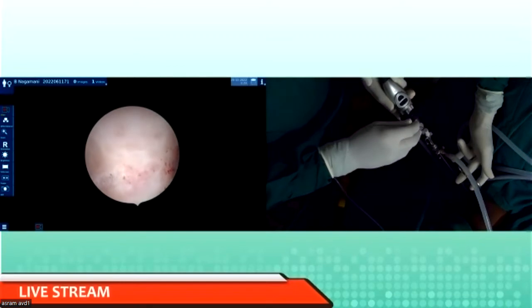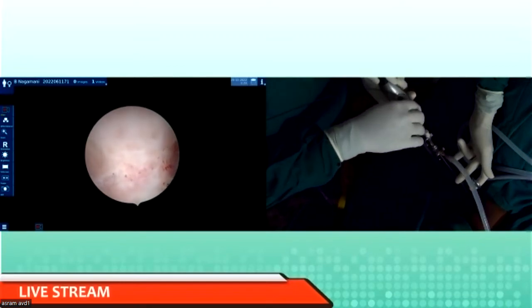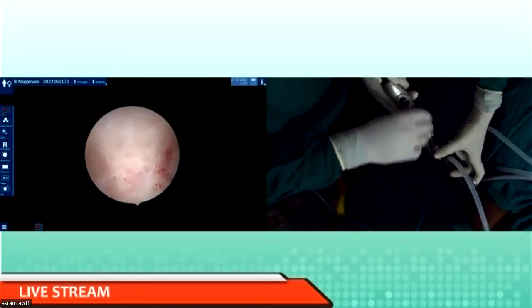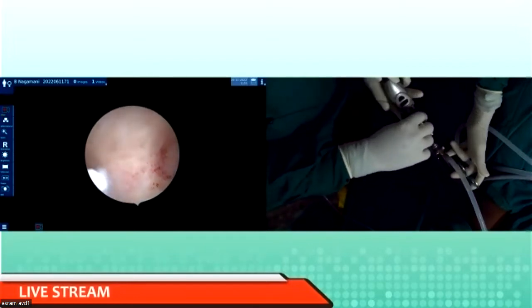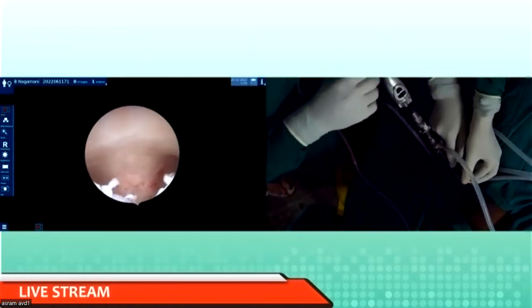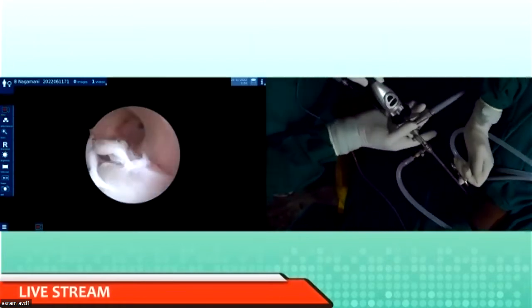Okay, Dr. Murmu. Sir, you are the one who has asked for this. Yeah, I will show you. Yeah, bipolar. Okay, this is a special bipolar needle. It's called a Bertucci needle. Okay, sir.